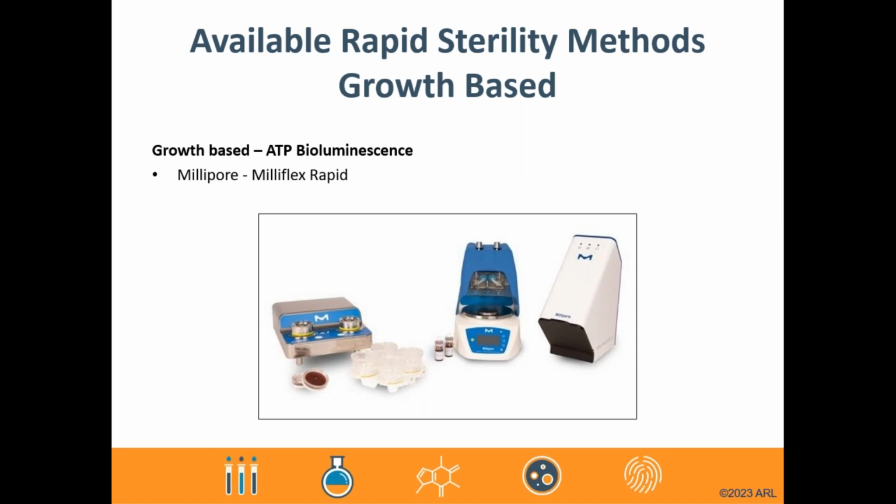One commonly used rapid sterility system which utilizes ATP bioluminescence is the Milliflex Rapid platform from EMD Millipore. Testing using this system entails the filtration of a sample, where then that filter is placed on an appropriate agar medium to allow for growth of microbial colonies if they're present. These colonies are then treated with an ATP releasing agent, followed then by the addition of that luciferin and luciferase combination, where photons of light from each colony are then detected by the luminometer and a cell count is reported. With this technique, it is also possible to continue incubation to form larger colonies or more colonies in the case that subsequent microbial identification is necessary.